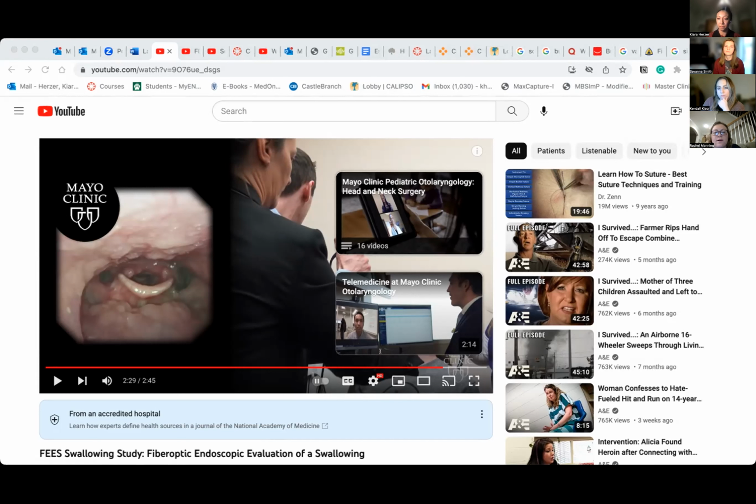Okay, good to know. Why did you put green food coloring in the applesauce, juice, and Teddy Grahams again? Of course, it's so the food and the liquid are more visible, just showing you exactly how it works and where it goes, just so you're able to see it better.